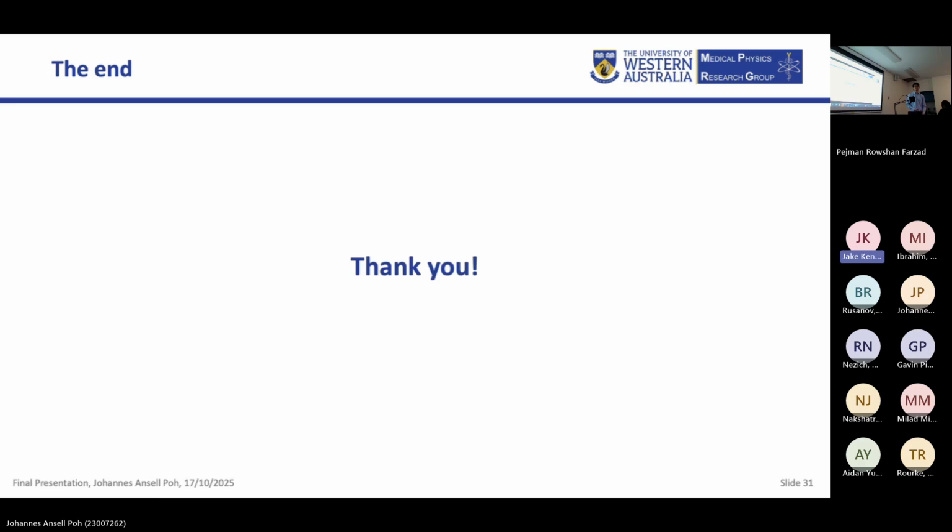And also I talked to Brani about this, and he said that the automatic contouring that he used for generating the treatment plans is struggling with the blurry synthetic CT image, but it works for my synthetic CT images with deformation fields. So the qualitative image comparison is also important.